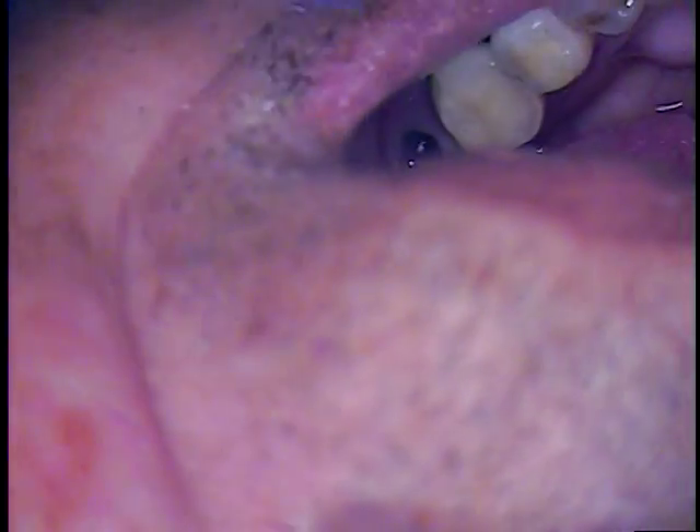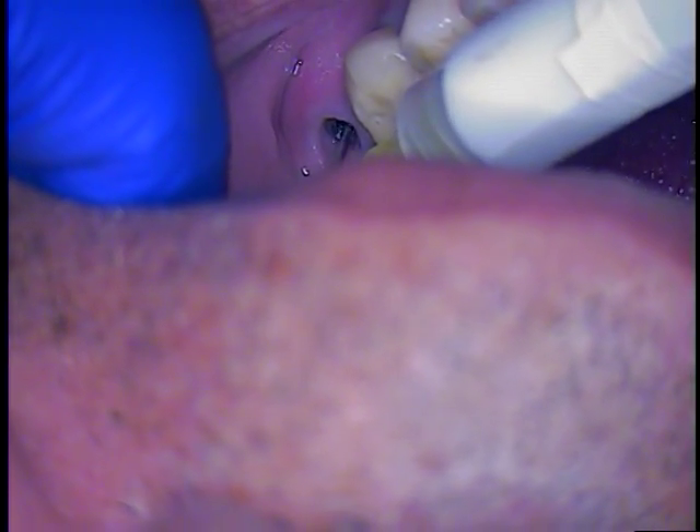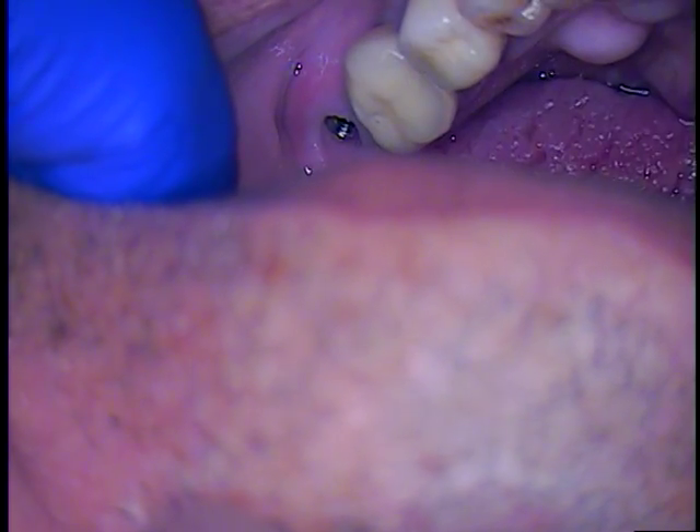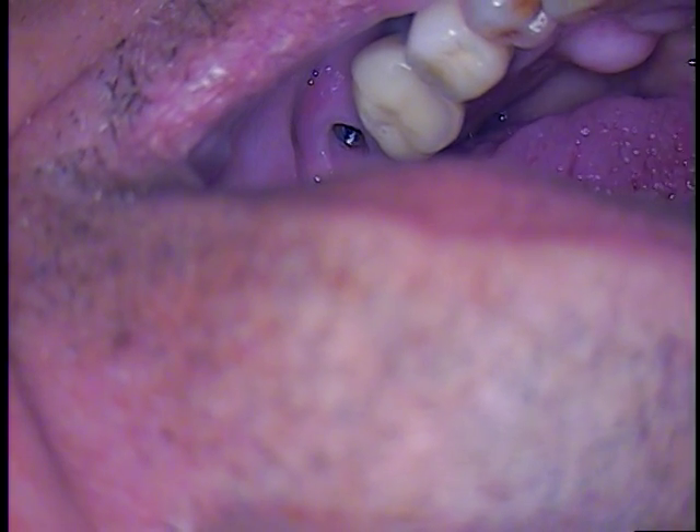Now we're going to use the micro suction and lubrication — everything comes down there. I'll get it bone dry just to look. We'll all take a look down there, then we'll put water back in there because we want lubrication — copious amounts of lubrication. The tissue is staying very nicely: no irritation, no bleeding, nothing to get in our way. Perfect vision here.